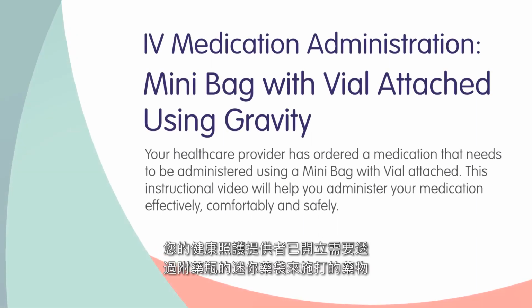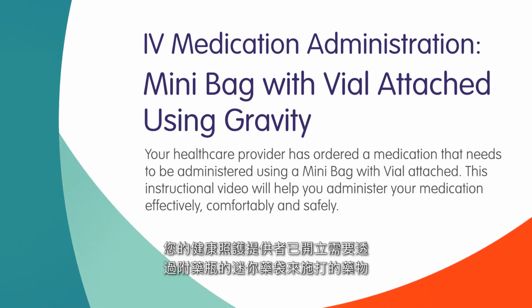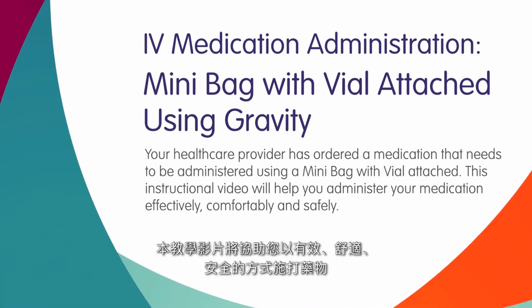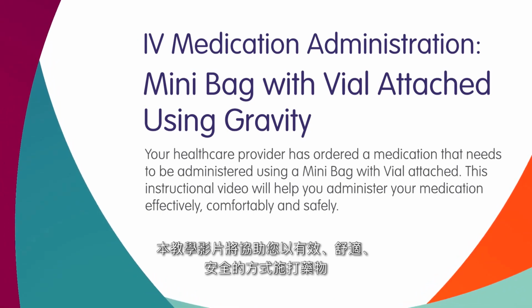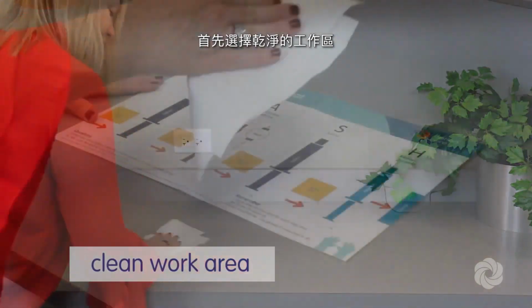Your healthcare provider has ordered a medication that needs to be administered using a mini bag with vial attached. This instructional video will help you administer your medication effectively, comfortably, and safely. To get started, select a clean work area.